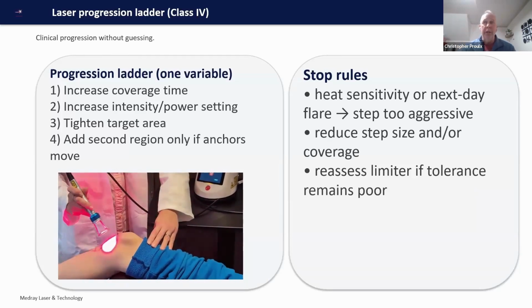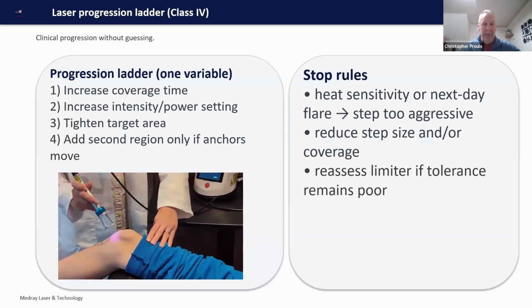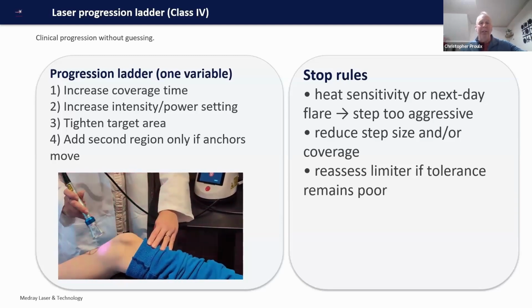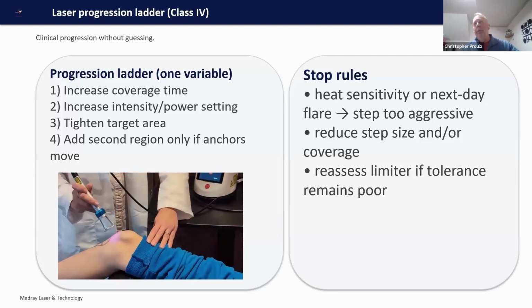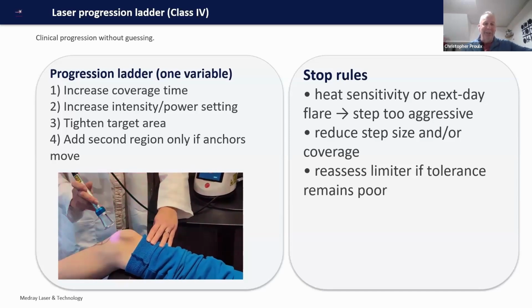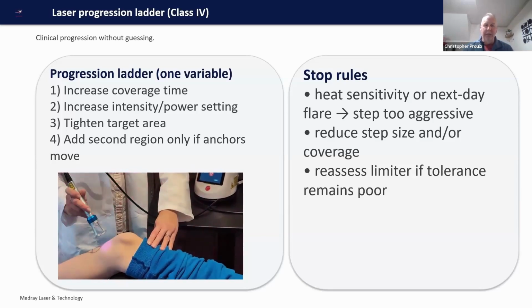So we can start with a lower energy density, and I promise you, relative to the lower power lasers we used to use, cutting a treatment protocol in half is not a bad start, right? And again, I don't overemphasize the whole pain thing. As you might imagine, I talk more education-wise and explain to them why we're doing that, right?